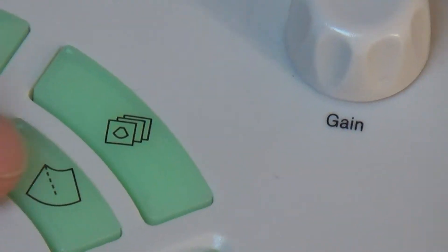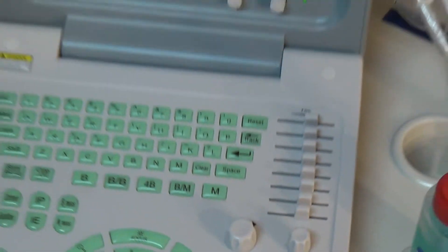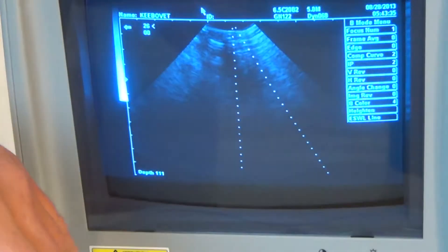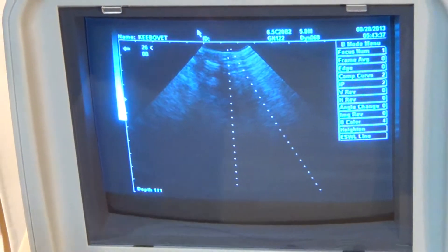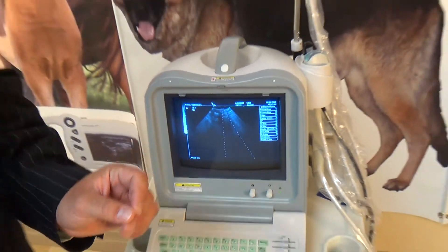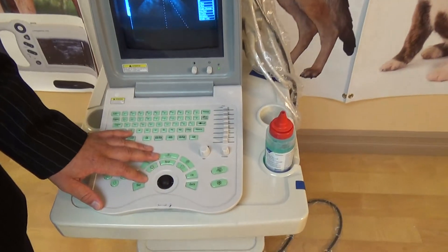Another button here is a screen with a data line — this is, for example, a biopsy screen. You can have biopsy adapters for our probes, or if you're specifically used to coming in at a certain angle, it basically gives you a line of sight for when you enter with a needle. Some people like to use that for biopsy, some people don't, but it is an option that is available for our machine.